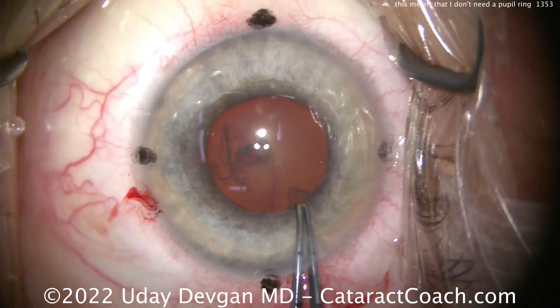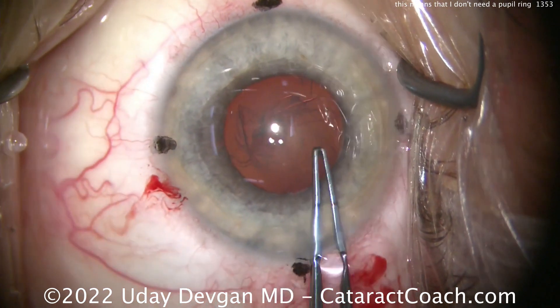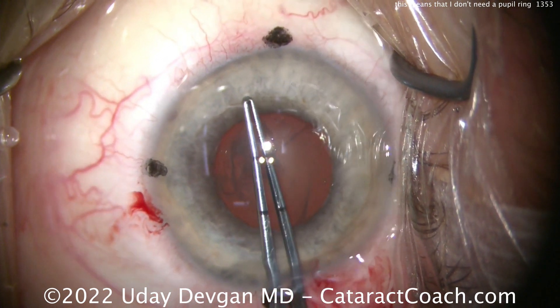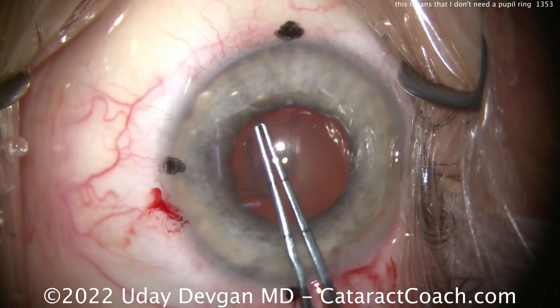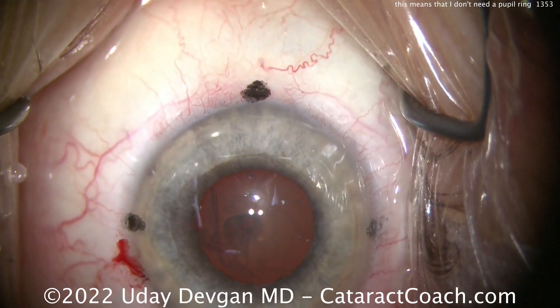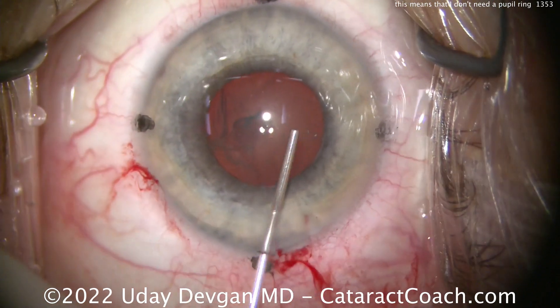We're going to do our capsulorhexis right up against the pupil margin. The reason I know I don't need a ring, hooks, or anything else is it's a five millimeter pupil to begin with. I do not need a bigger pupil than five millimeters — and hey, surprise, neither do you. So don't put a pupil ring in this case. You don't need it.